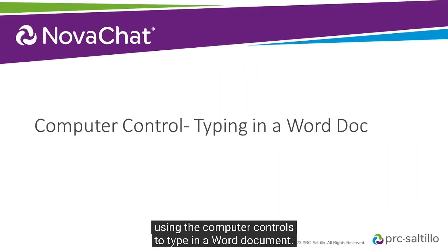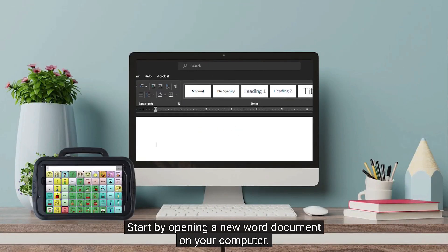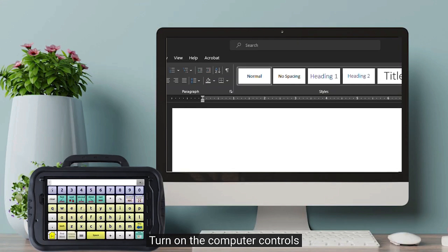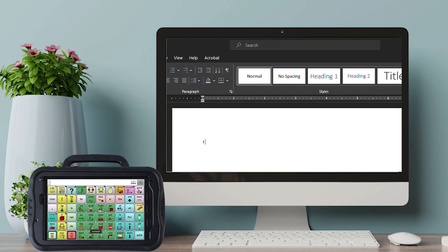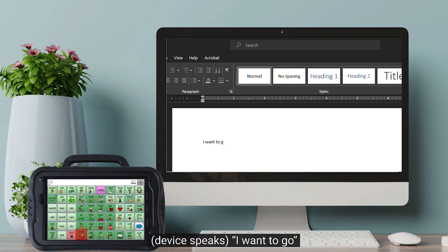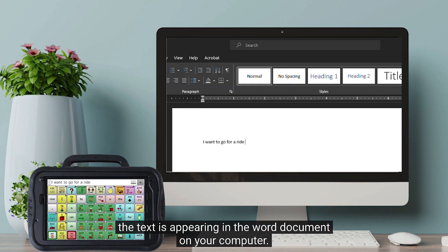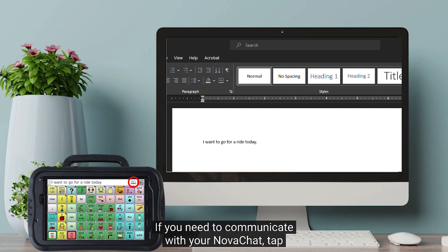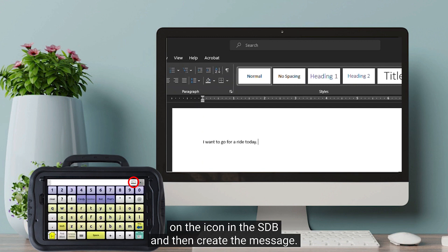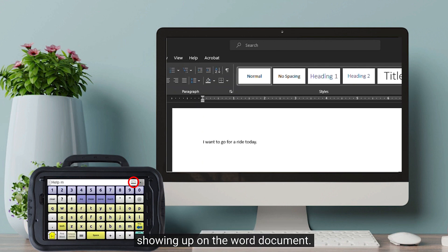Let's try out using the computer controls to type in a Word document. Start by opening a new Word document on your computer. Turn on the computer controls and then start creating your message. As you are creating your message on your NovaChat, the text is appearing in the Word document on your computer — for example, "I want to go for a ride today." If you need to communicate with your NovaChat, tap on the icon in the SDB and then create the message. While in Communication Mode, you won't see the text showing up on the Word document.